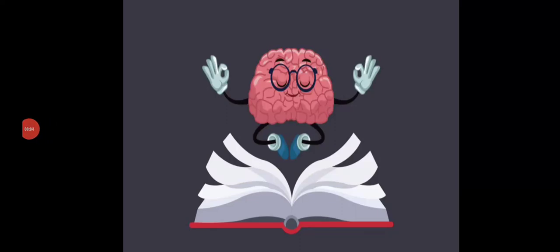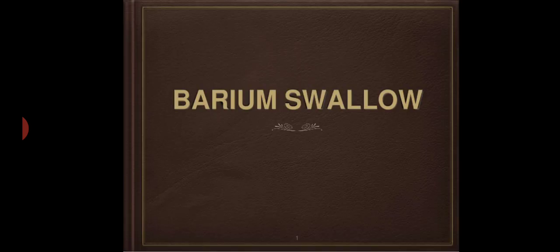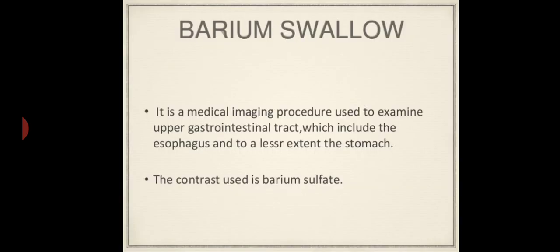This is my new video and today's topic is Barium Swallow. So what is Barium Swallow? It is a medical imaging procedure used to examine the upper gastrointestinal tract, which includes the esophagus and, to a lesser extent, the stomach. The contrast used is barium sulfate.